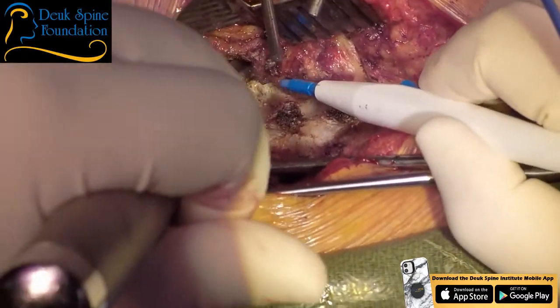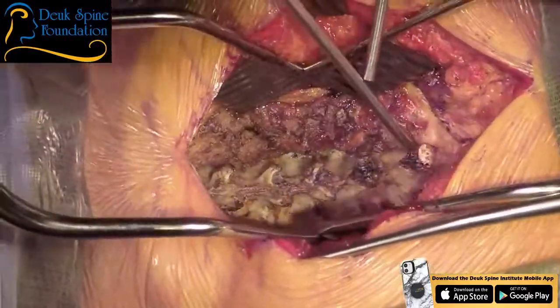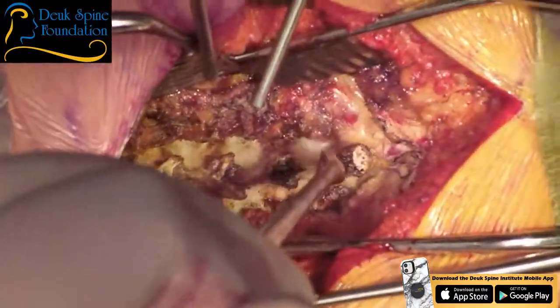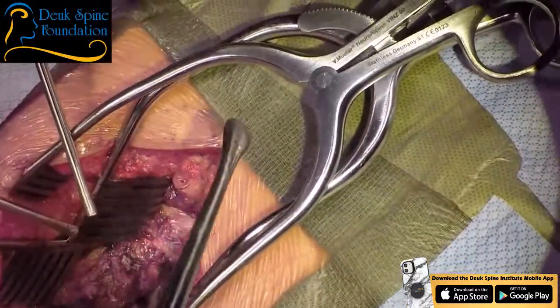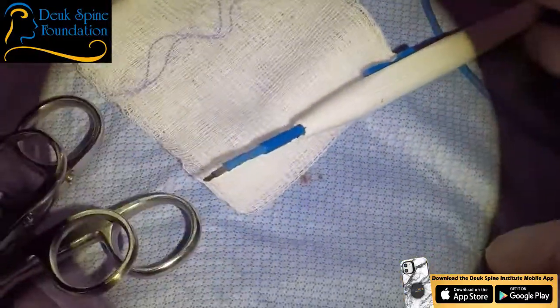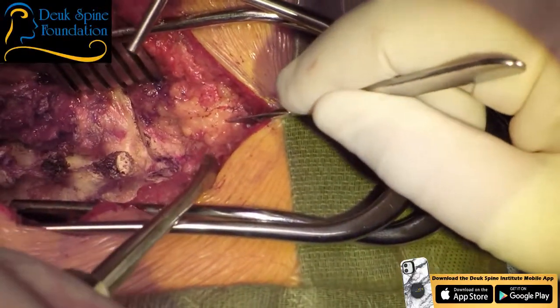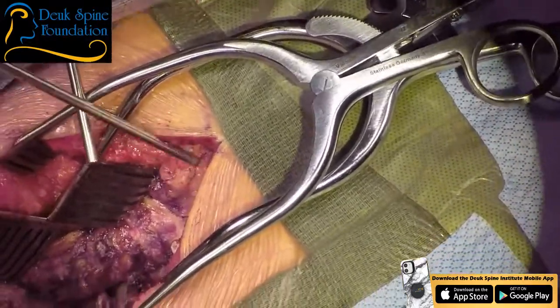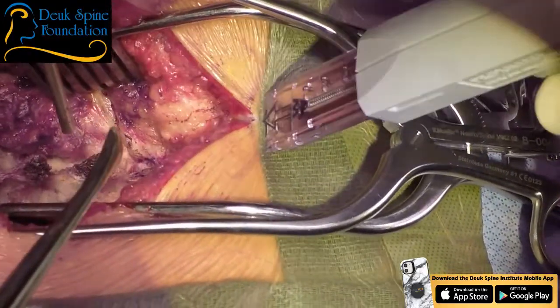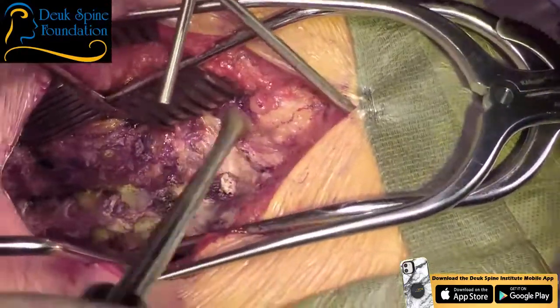We've lost probably 5 mL of blood so far. I don't expect to lose much more. So I probably will keep this under 20 mL for the whole surgery. All right, we believe that's C2, then that would be 3, 4, 5, 6, 7. So we still need to go a little bit more inferiorly. How close is this to our tape? It's on the tape? Yes, sir. All right, so let's have a knife. I'm going to just take it right up to it. You have a stapler? Yes, sir. Let me have it. Thanks. Bovie.